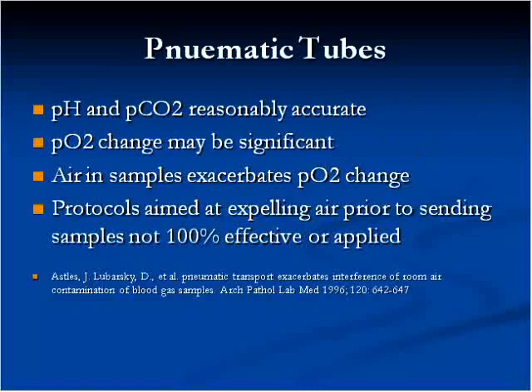And I think a lot of times blood gas samples are pneumatic tubed from the emergency department, and perhaps, I don't know, but I suspect that some individuals that draw those blood gases have not drawn that many and are less proficient at blood gas draws than some of the respiratory therapists who have done literally hundreds or thousands of blood gases in their careers. So my advice is it is probably best not to pneumatic tube the sample.